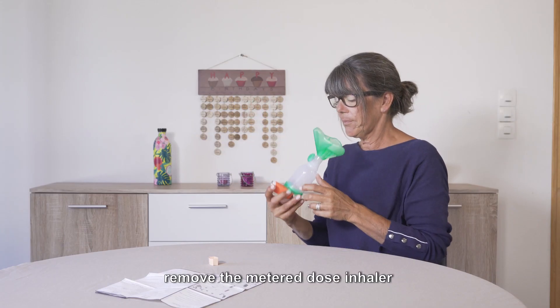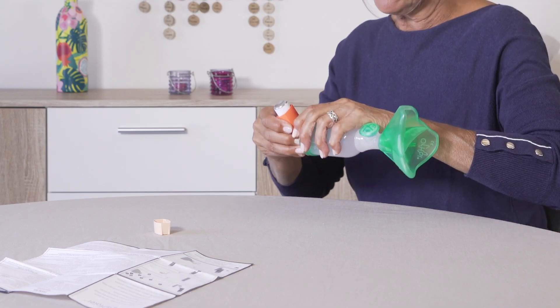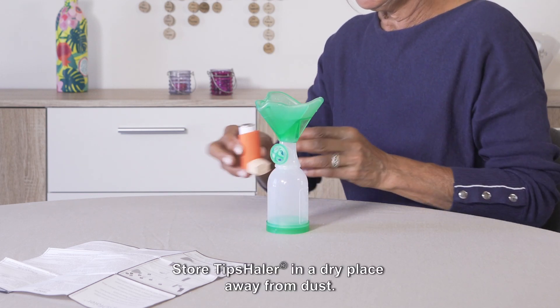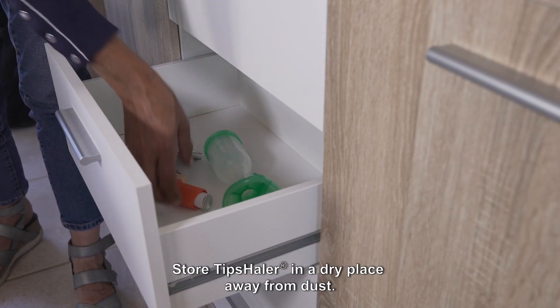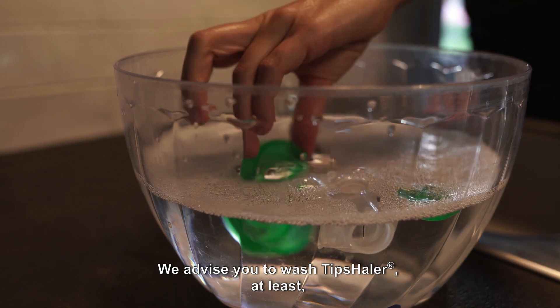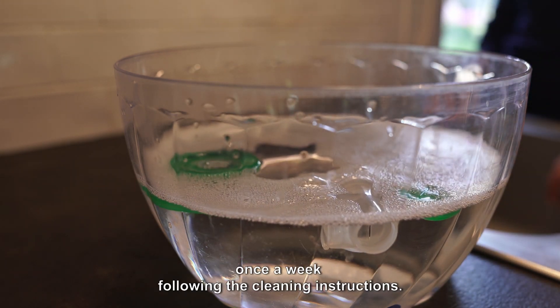After use, remove the metered dose inhaler and replace the cap. Store TipsHaler in a dry place away from dust. We advise you to wash TipsHaler at least once a week following the cleaning instructions.